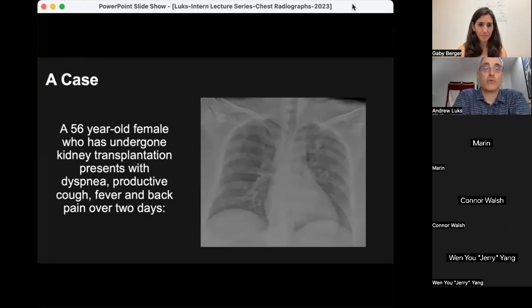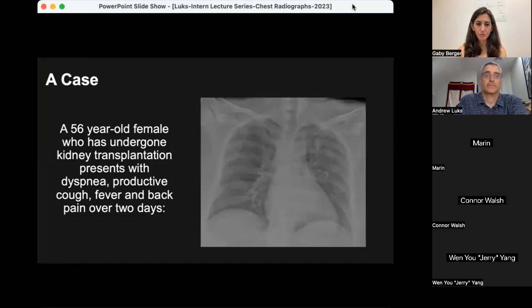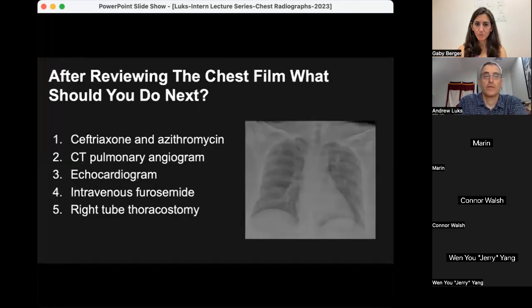Now we'll move on to our second case. This is a 56-year-old female who's undergone a kidney transplantation and she presents with dyspnea, productive cough, fever, and back pain over a two-day period. Here is her chest radiograph — take a look for a couple of seconds.